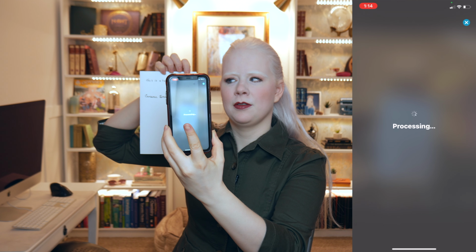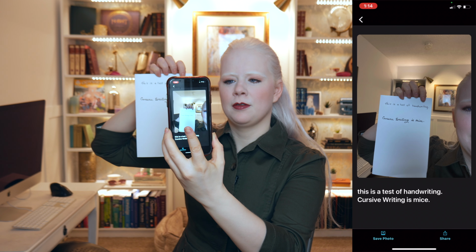Take picture. Processing. Cancel. Button. This is a test of handwriting.